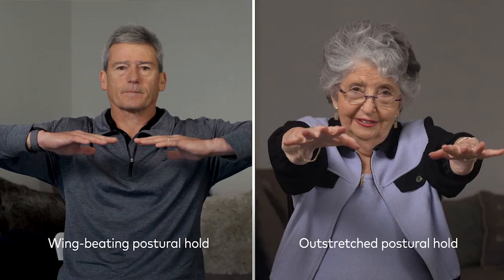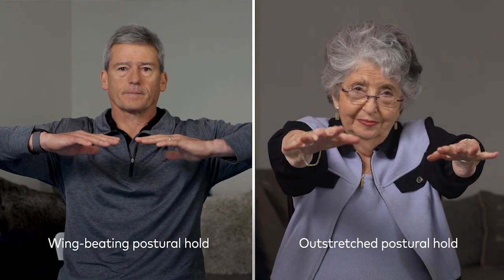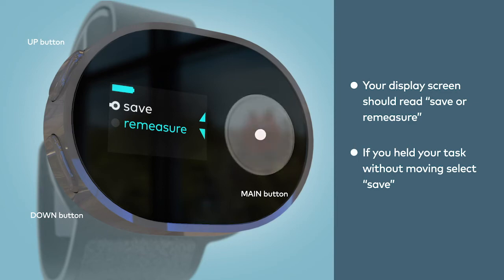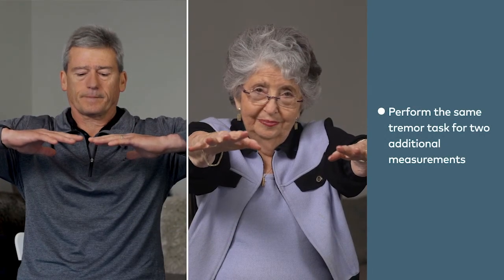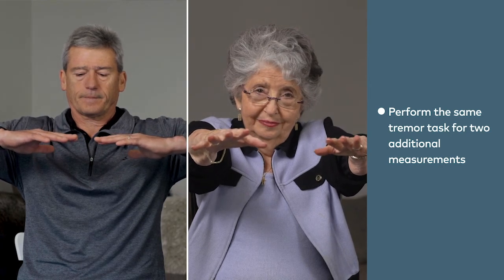As you hold your tremor task, do not try to suppress your tremor. After the vibration, your display should read 'Save or Remeasure'. If you held your task without moving in a way unrelated to your tremor, like walking or talking, select Save. Once you've saved the measurement, you'll be asked to repeat this step two additional times. Perform the same tremor task for the additional measurements.